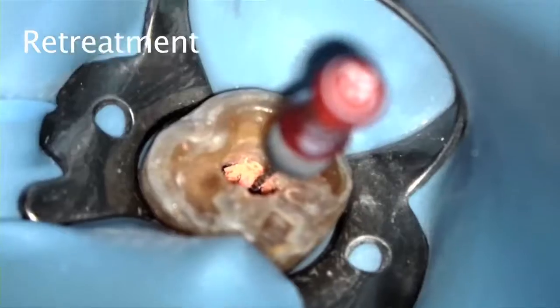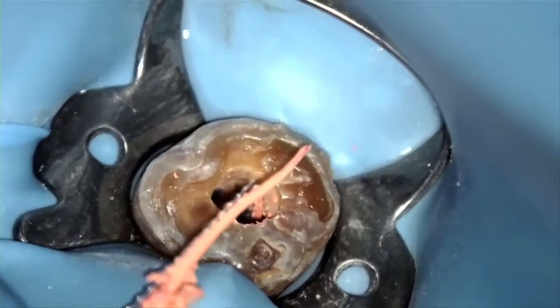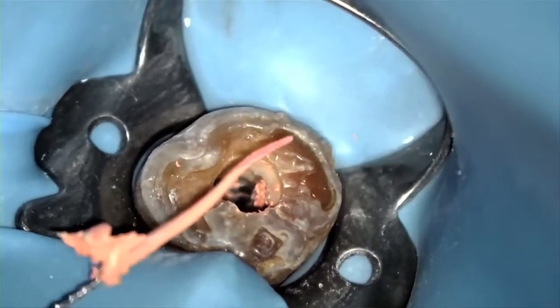Now I'll speak about retreatment. In the unlikely event you need to remove your GuttaCore, I recommend using a Hedstrom file for engaging and removing the GuttaCore. As seen in this video, turn a Hedstrom file in a clockwise direction to engage into the GuttaCore and pull the file coronally. This is very easy to perform, especially before the GuttaCore has fully set.